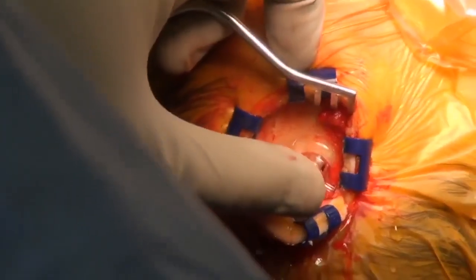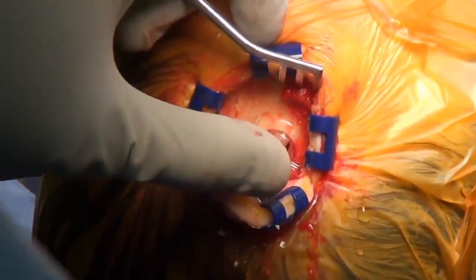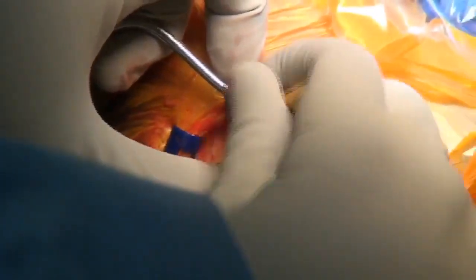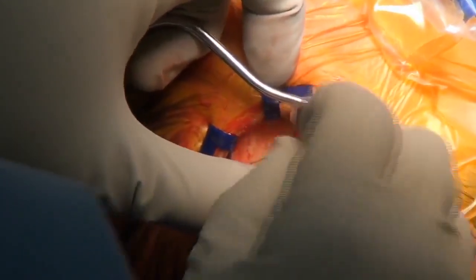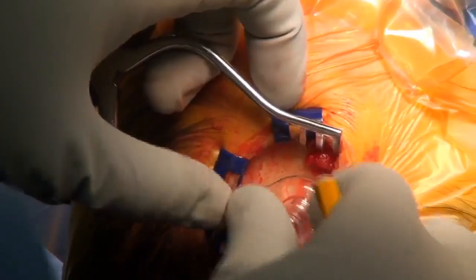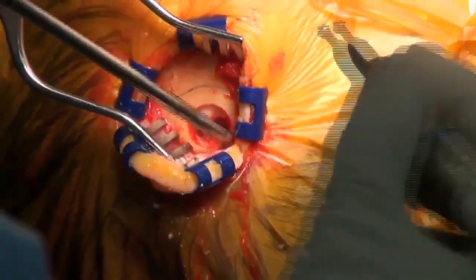Yeah, we're good. Okay. Let's do the pencil. That's fine. All right, we've marked this out. We're just going to drill down the bone a little bit because you'll see the little device that we use to lock the wire in place in a manner that doesn't crimp the wire but secures it, leaves a little bump.